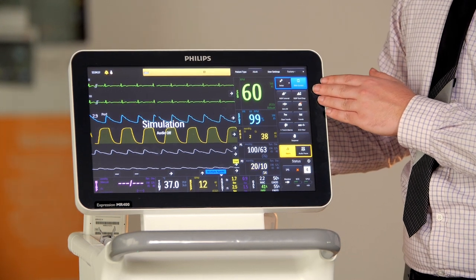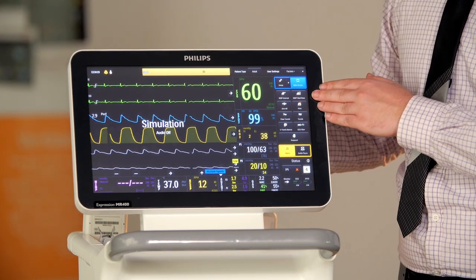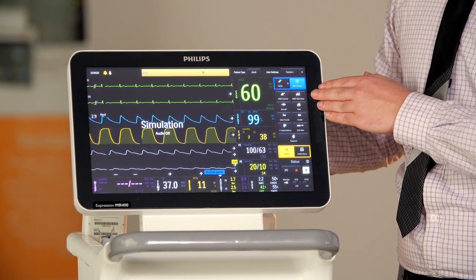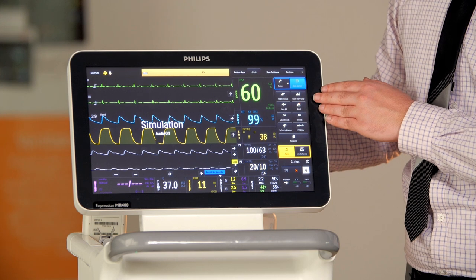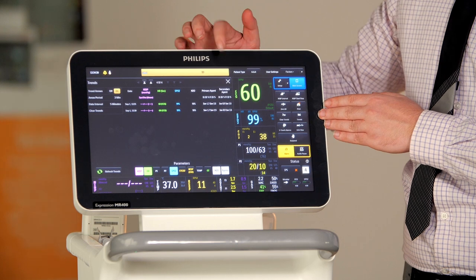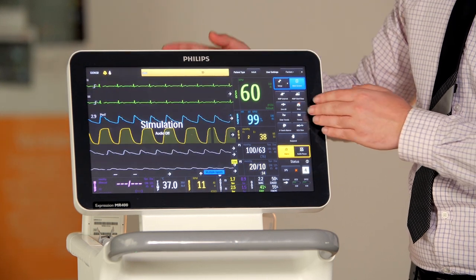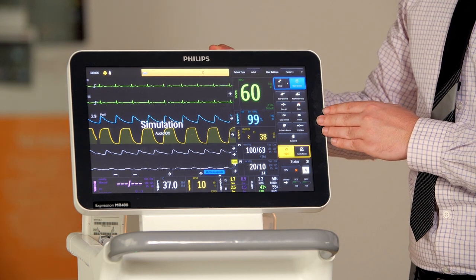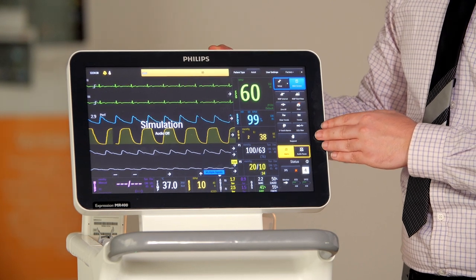From the quick function buttons you can go into the main monitor setup, manually start and stop the non-invasive blood pressure, change the cycling interval for the non-invasive blood pressure, zero all the pressure channels, set up your trends to determine which ones you want to see, clear all of your trend lines, set up one touch alarms, change the ECG filter, and take the monitor in and out of suspend mode.